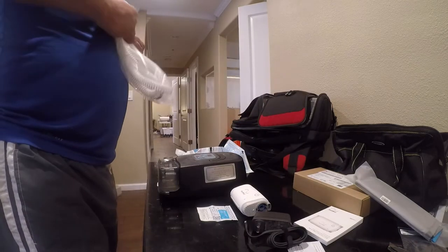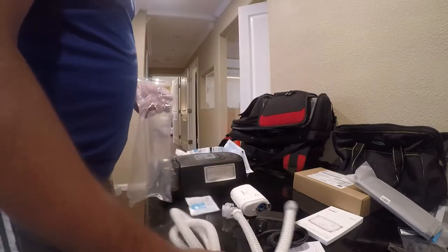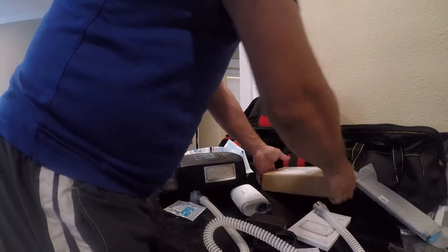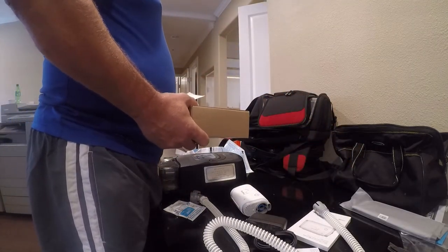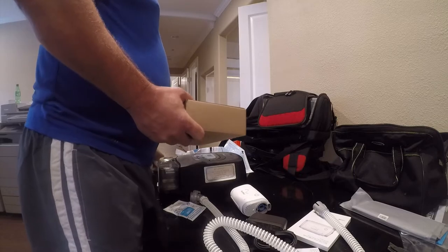I did decide to buy an AirFit full face mask. I currently use a Fisher Paykel mask, but I wanted something small for traveling. It looks like they forgot to send me the case — maybe I didn't order it.